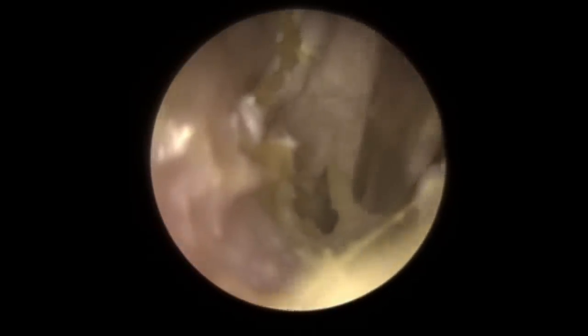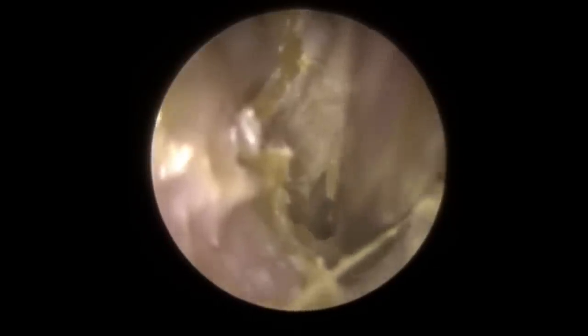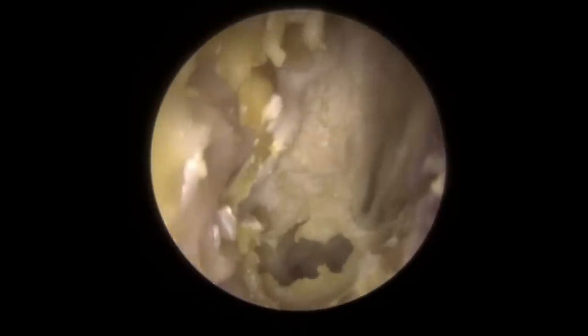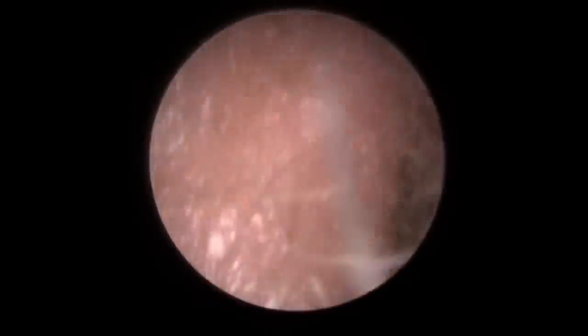Because we're not able to get it from the sides, I've aimed for a loose piece I can see moving at the bottom. I'm going to hold the suction on there and let the grip build. You can see it's actually sucked a hole through — this is a layer that's built up just in front of the eardrum, so I've got a bit of room to play with. The challenge is this is one continuous layer that's gone from one canal wall, across the eardrum, to the opposing canal wall. The side pieces are holding it in and I can't get enough grip on them to detach those first.